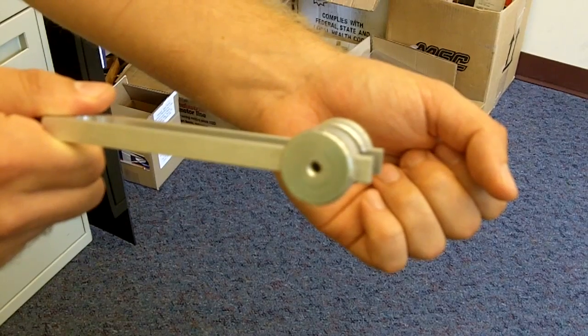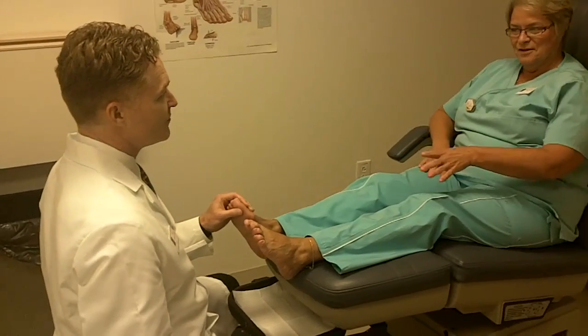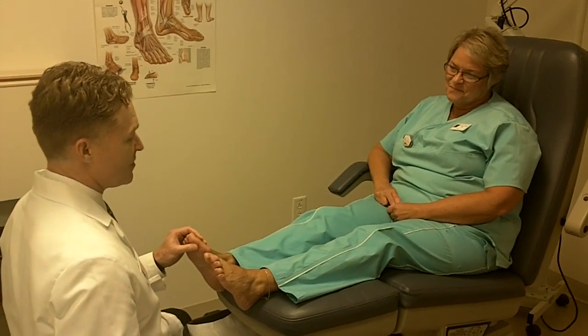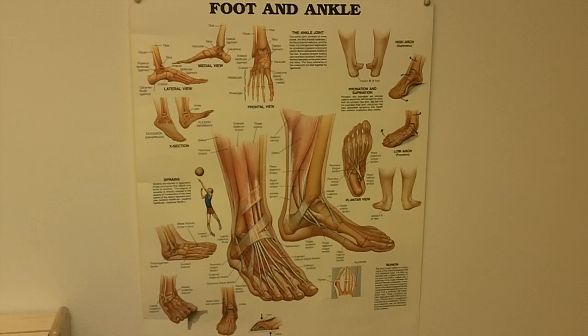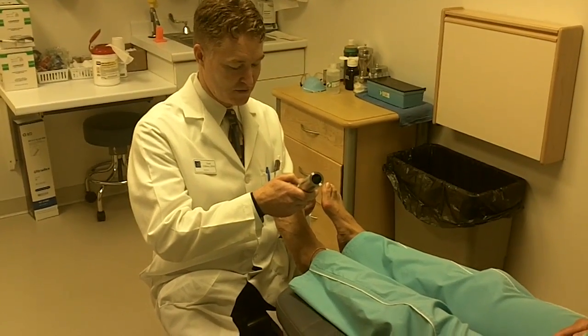The tuning fork has been a critical tool in the medical field for decades. It's an effective device for measuring neuropathy, or nerve damage, which can limit sensitivity to touch. People are, in general, if their sensation's intact, very sensitive to vibrations that are created with this tuning fork we have. If patients can feel it for a significant amount of time, we think they have normal vibratory sensation.